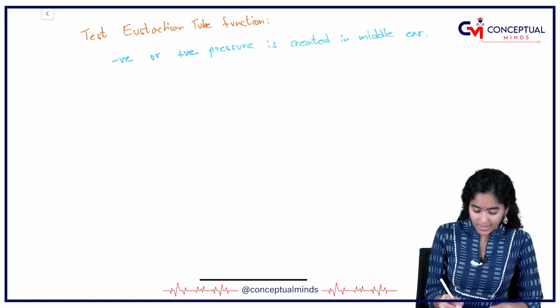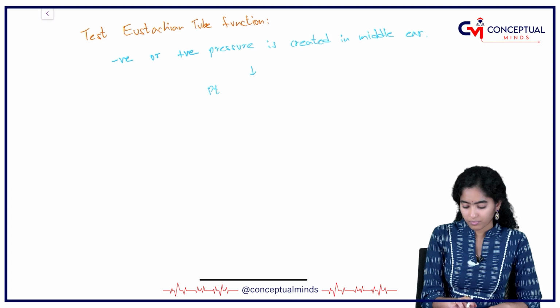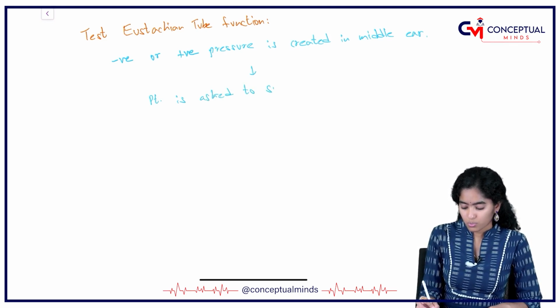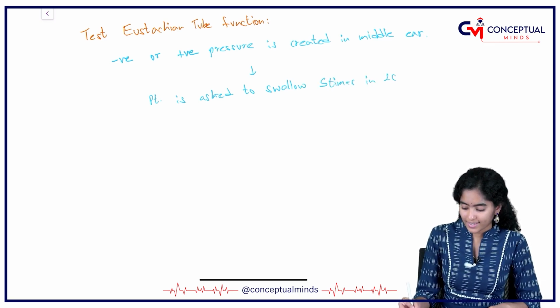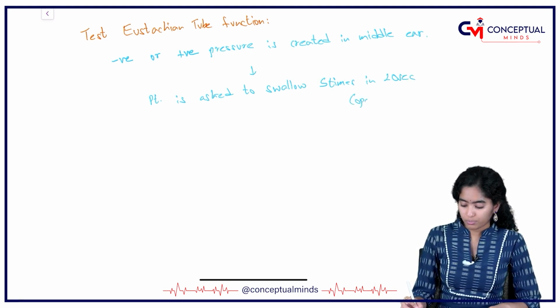And then the patient is asked to swallow. Patient is asked to swallow for 5 times in 20 seconds. This will open the Eustachian tube.